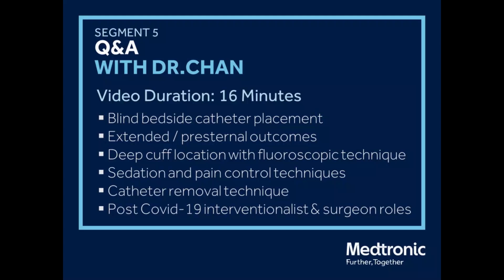You may be a little lateral. But in my experience, if you're a little lateral to the left or right, it's not really going to cause an issue in terms of performing peritoneal dialysis. Once your wire is fed in, then you can use a dilator like we use, or you can dissect a little bit into the rectus and feed that sheath. The sheath should go in easily. And once your sheath is in, you do the exact same thing and just feed that catheter in. Obviously, you'll get an X-ray just to make sure it's in the pelvis. Again, if it's left or right, you still can do PD. It's really based on surface area and how much contact the dialysate has with the peritoneum and the peritoneal vessels, the microvasculature.